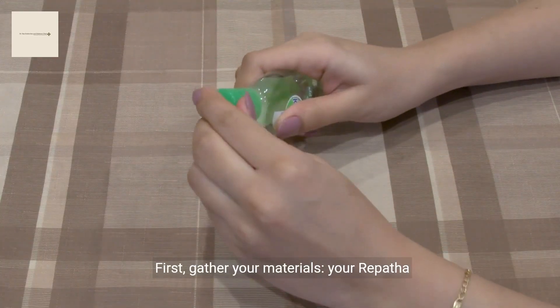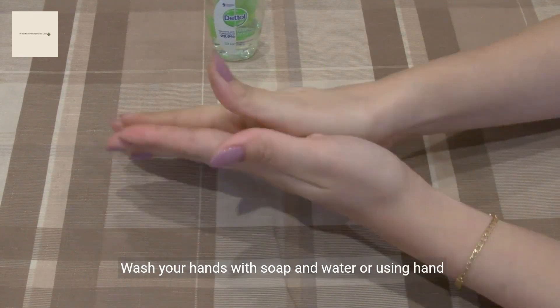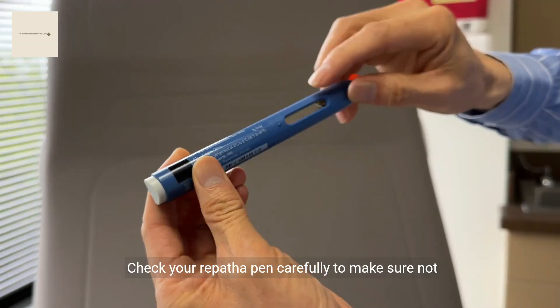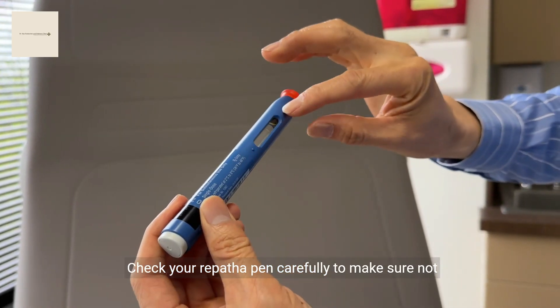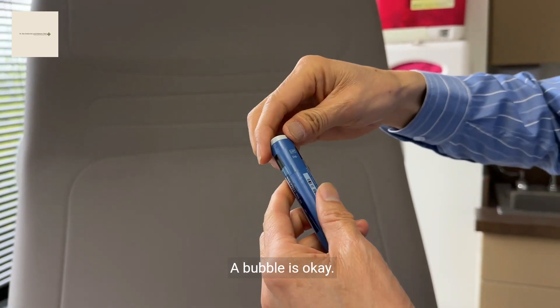First, gather your materials: your Repatha SureClick auto-injector and an alcohol wipe. Wash your hands with soap and water or using hand cleanser. Check your Repatha pen carefully to make sure it is not expired, not damaged, and that the medication is clear with no clumps. A bubble is okay.